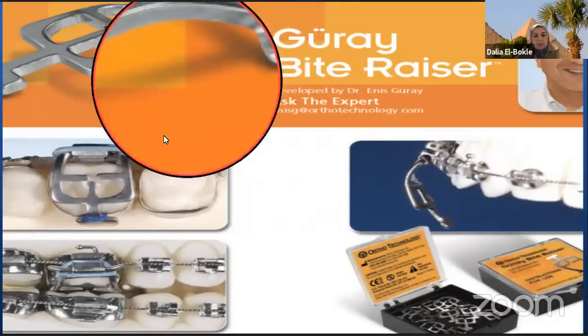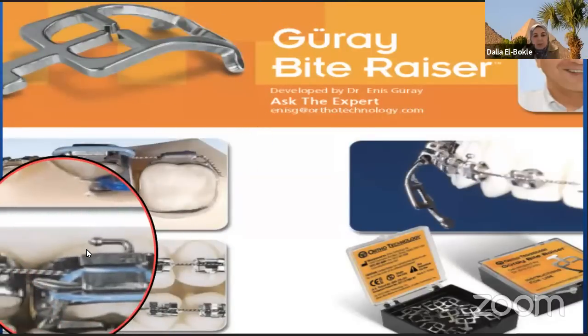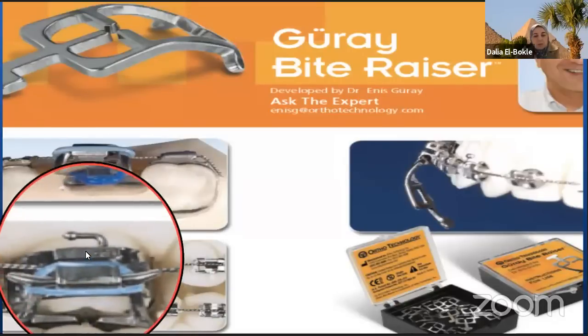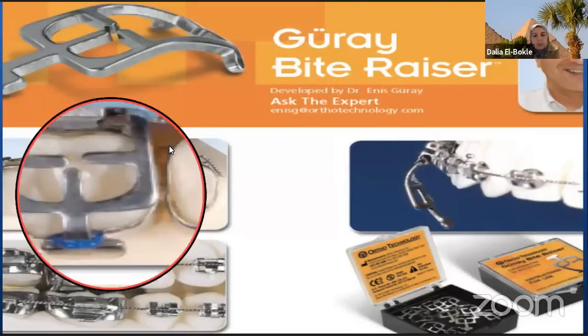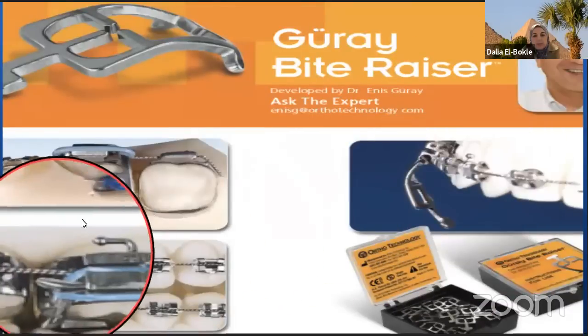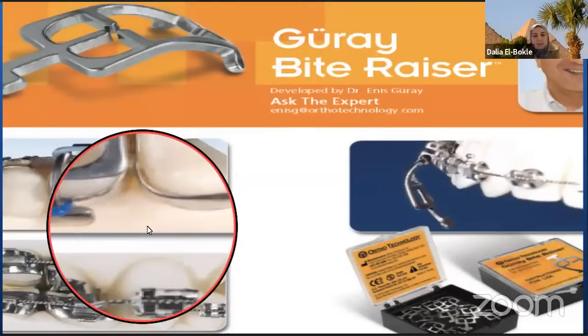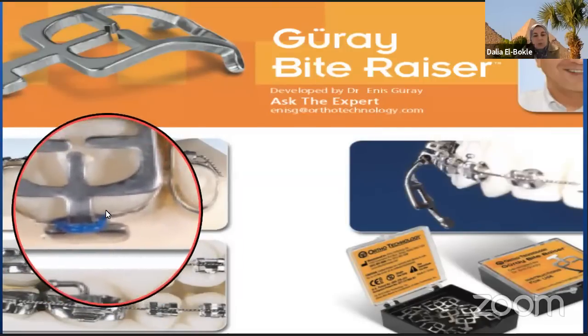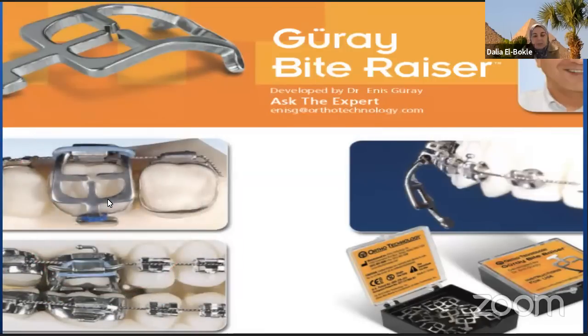So you can appreciate here how it is placed using an O-tie to the molar tube, and then it's rotated over to be placed on the cleat on the lingual side of the molar tube, of the molar band, sorry.